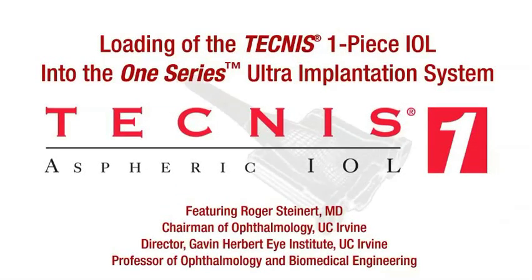The following demonstrates loading of the Tecnis One Piece IOL into the One Series Ultra Implantation System, courtesy of Dr. Roger Steinert.